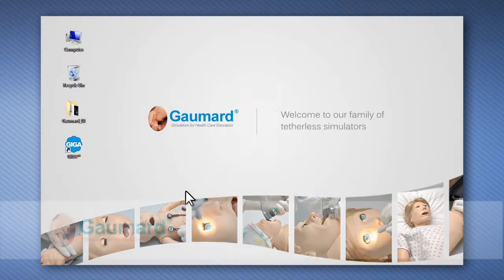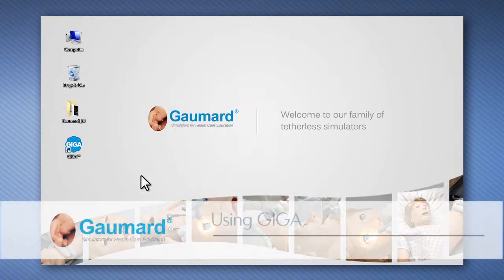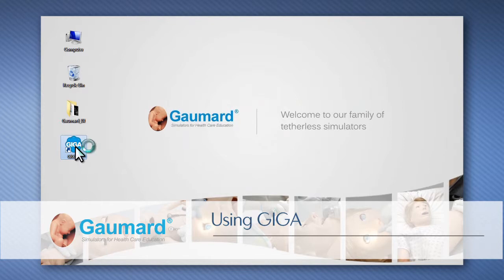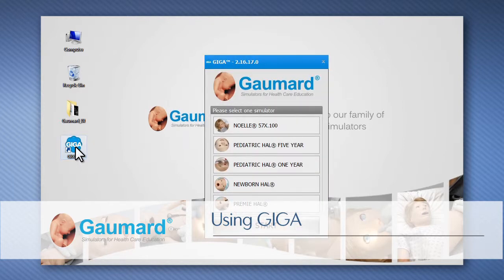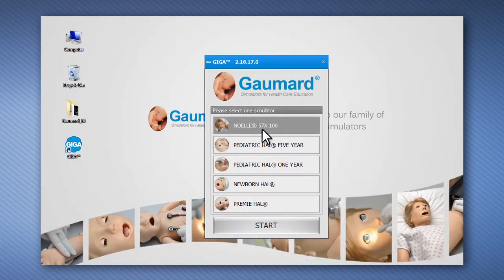The GIGA Simulator Control software is preloaded onto the tablet PC. Click the GIGA icon to start the software and to initialize NOEL.